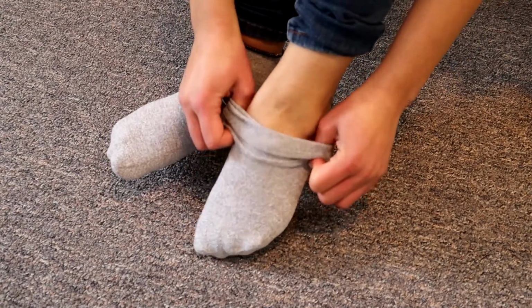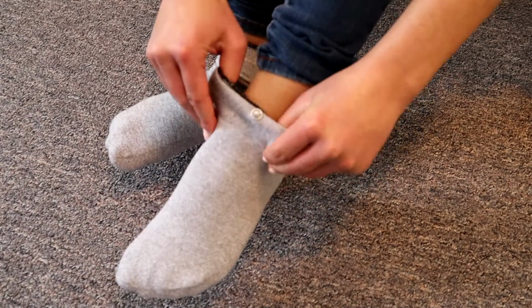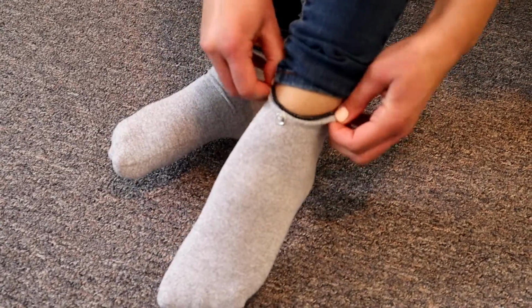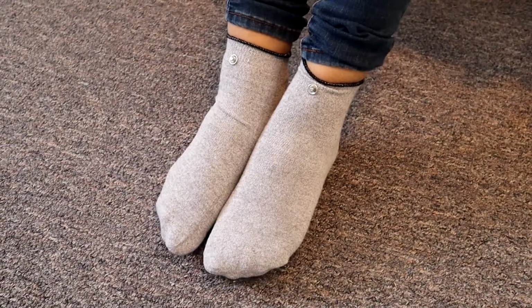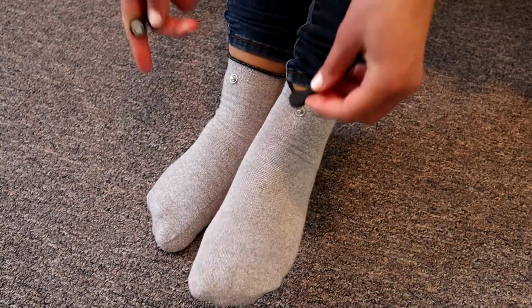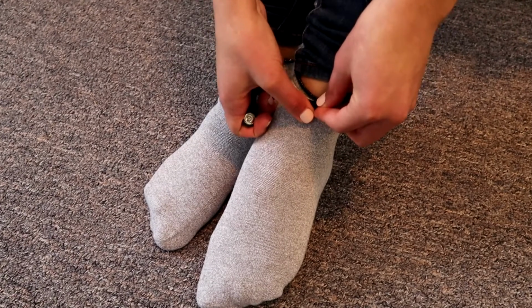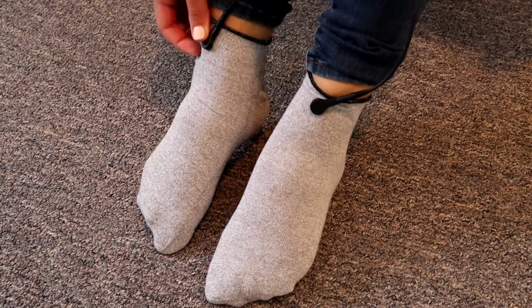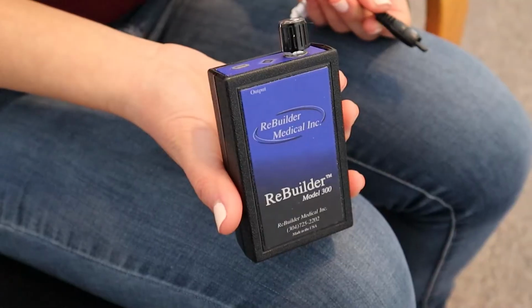After treatment, reverse the process to remove the socks and refer to the instruction manual for care and cleaning information. Attach the snap connectors back onto the socks. You can have the snap connectors attached to the socks as you roll them on, and then connect the lead wire. Use whatever method is easier for having the snaps connected with the lead wire.